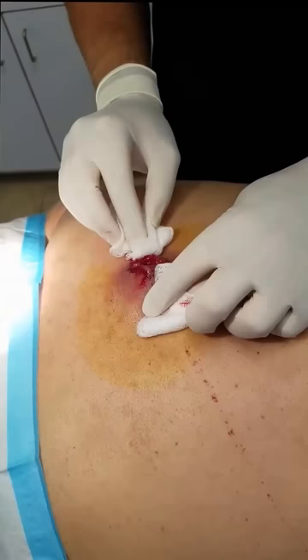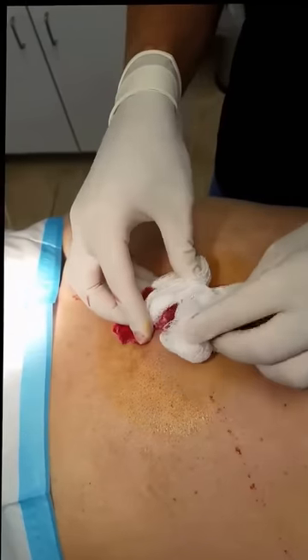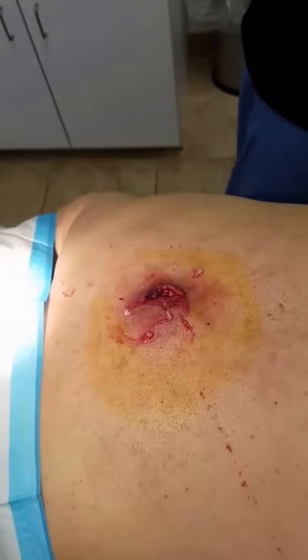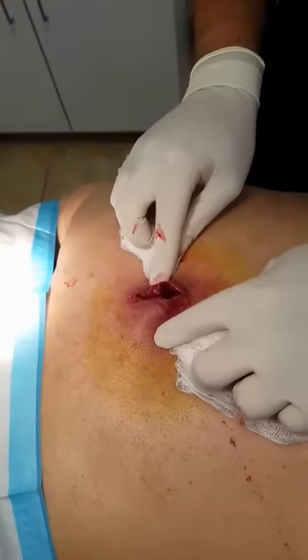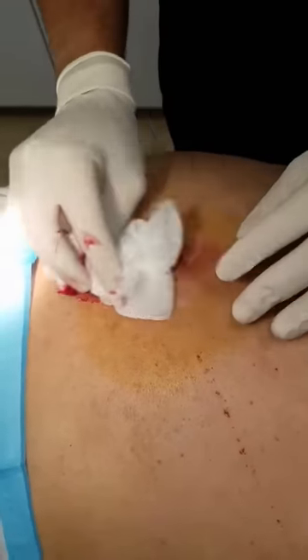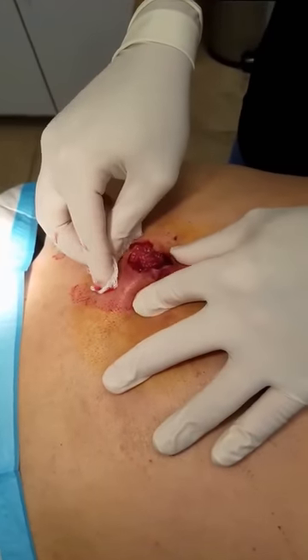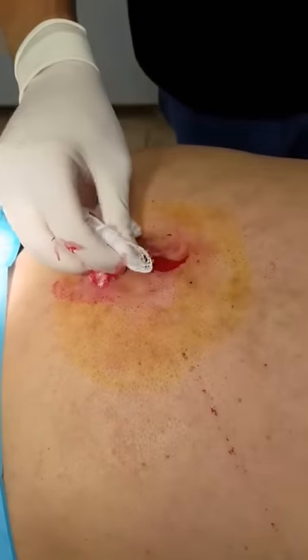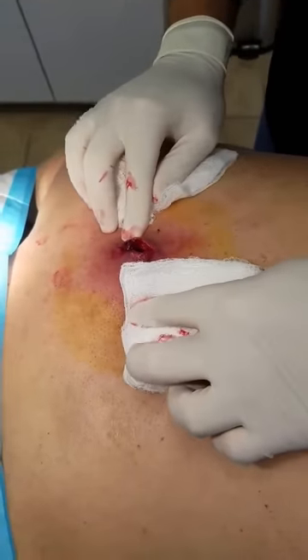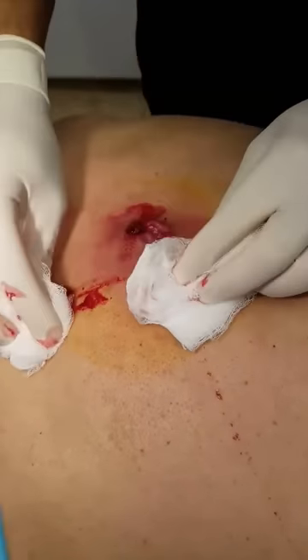We'll grab our gauze and just pop all the infection out of it. You okay? Yes, I am. Excellent. You can see we've expressed quite a bit of the infection.